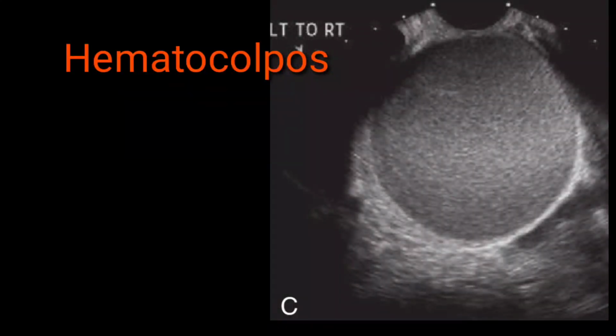Again, the same patient, with a better understanding and the best resolution, on transvaginal scan. On this transvaginal scan, you can clearly see a large complex cystic lesion. You should not confuse this with an adnexal cyst because you have to perform both. Therefore, it is a recommended strategy whenever you are doing a pelvis scan: go for the transabdominal scan to have a broader view, and if any pathology is suspected, then go for the transvaginal scan, and after the transvaginal scan it would be clarified.